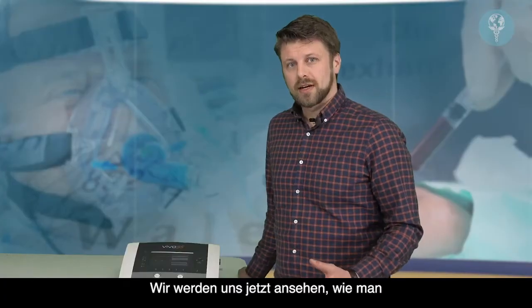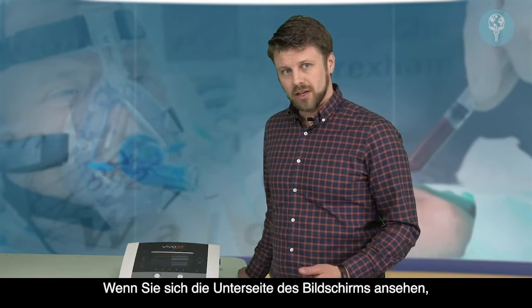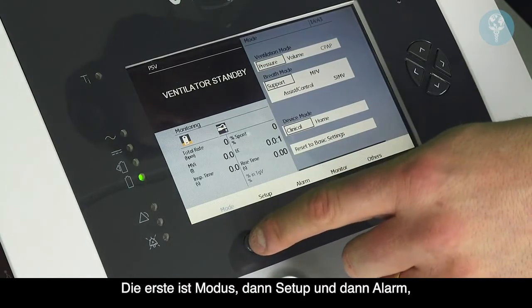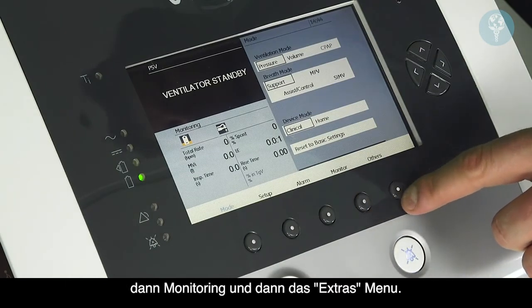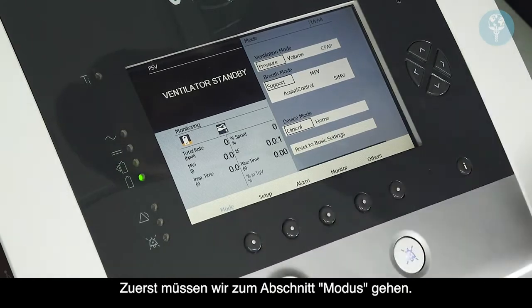We're going to look now at how to set up a patient prescription on the Vivo 55. So if you look at the screen on the underside, you have 5 buttons across the bottom here. So the first one is mode, and then setup, and then alarm, and then monitoring, and then the others menu. So what we need to do first is go into the mode section.